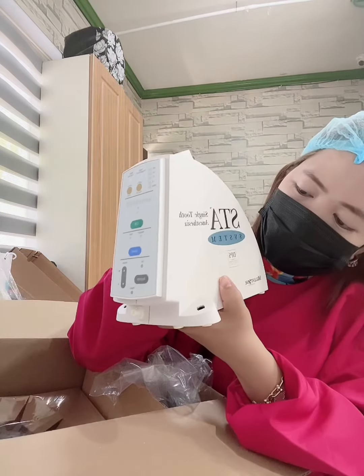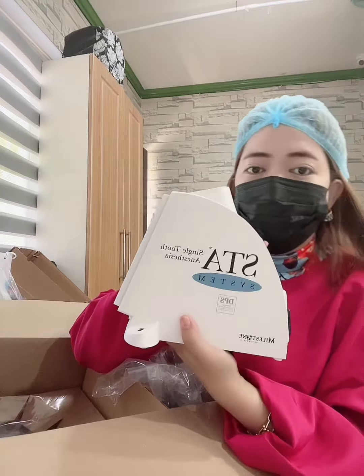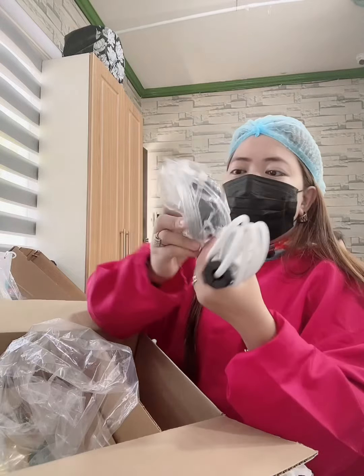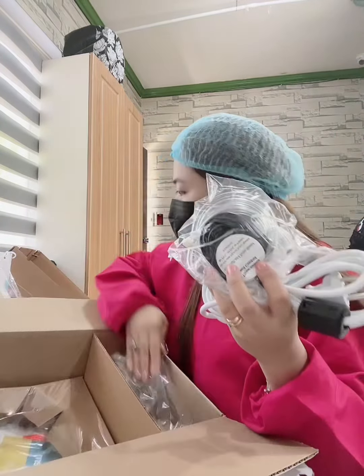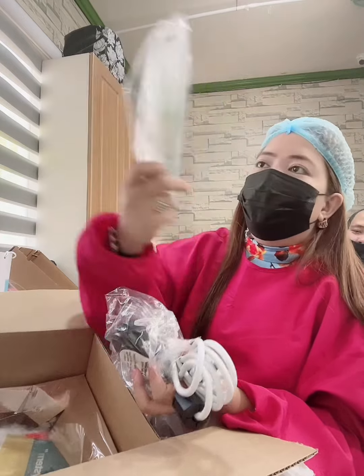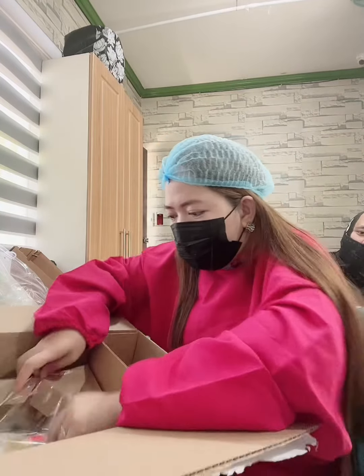Single tooth anesthesia system. So there is the adapter, and there is a pedal. Then this one, the tips are available.